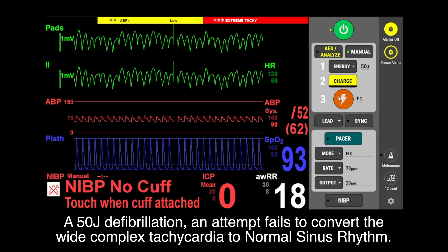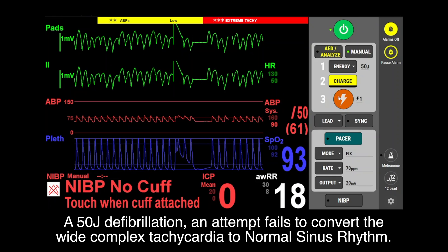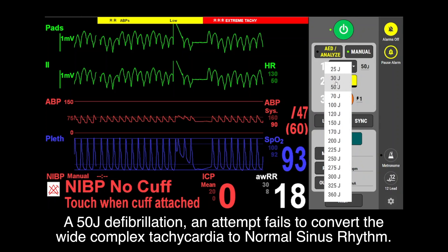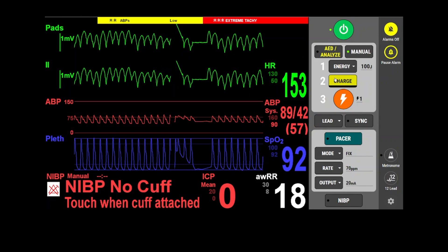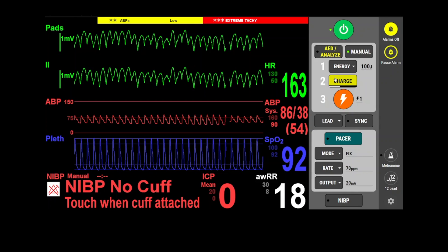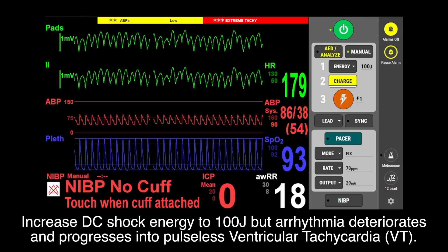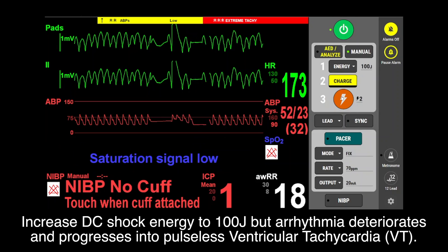A 50-joule defibrillation attempt fails to convert the wide complex tachycardia to normal sinus rhythm. DC shock energy is increased to 100 joules, but the rhythm deteriorates and progresses into pulseless ventricular tachycardia.